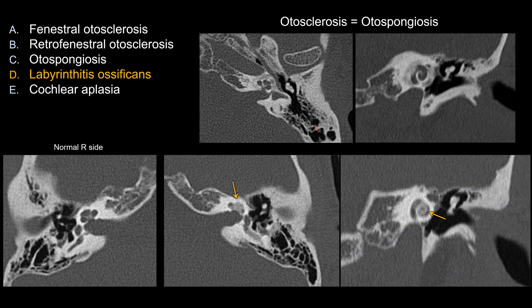For otospongiosis or otosclerosis, instead of abnormal density inside, you should see abnormal lucency outside. A normal otic capsule should be dense bone, so if you see abnormal lucency outside, that's otospongiosis or otosclerosis. In this case, the extensive form surrounding the cochlea is the retrofenestral or cochlear form of otospongiosis.